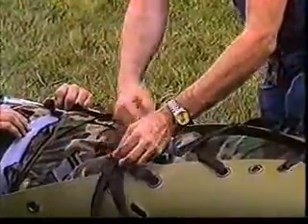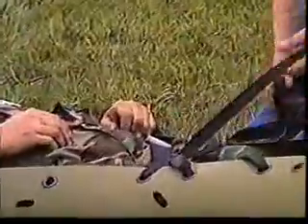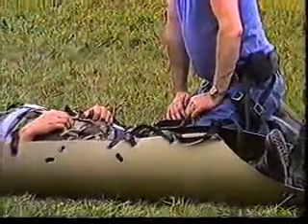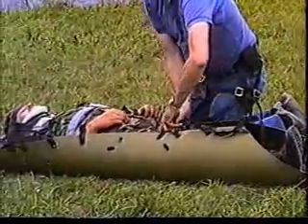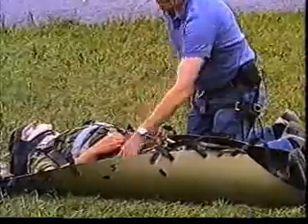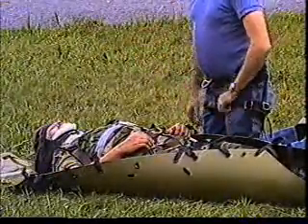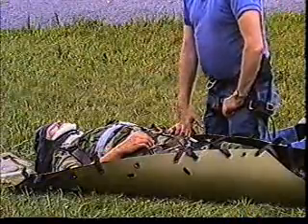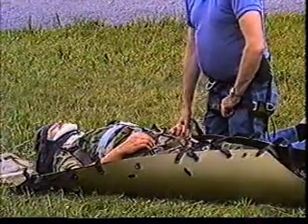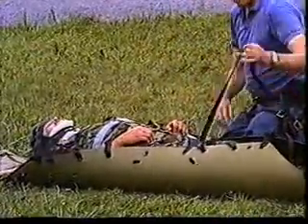The one thing, if a patient is immobilized properly, he's not going to be comfortable. You want your hands in or out. Okay, at this point, if we wanted to have an IV, if you don't have a pressure infuser, you can put the IV bag in here, tighten up the stretcher, it'll put pressure on the bag, and it will put fluids into the body. Also keep the tube inside here so that you don't have any brush or anything snag it and pull it out. Okay, now, pull that up where it's snug.